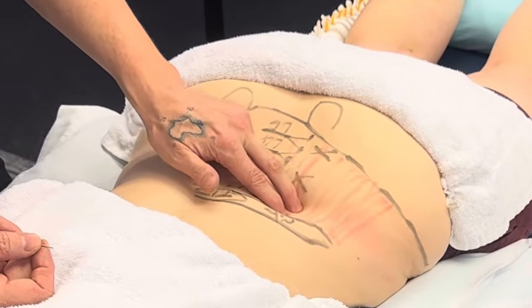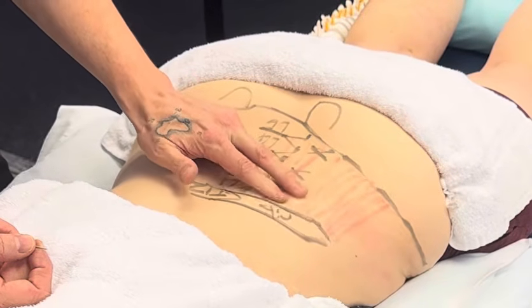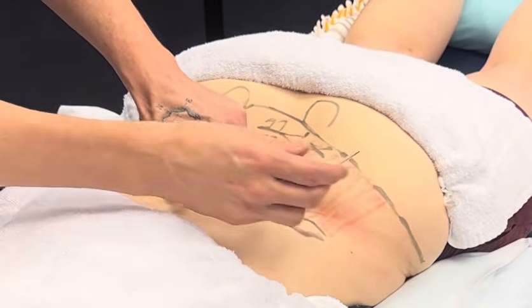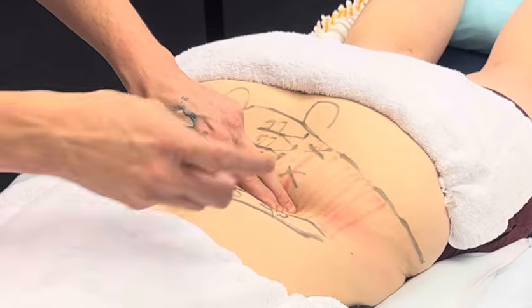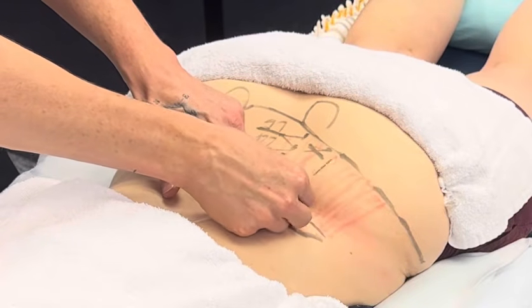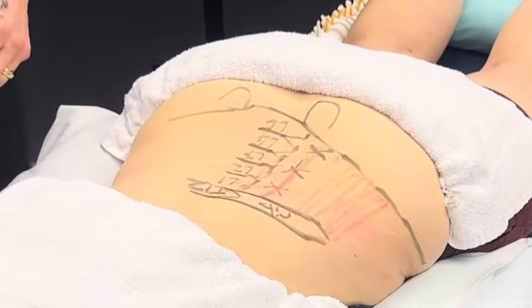So again, forget what you can see. Just gonna roll over the paraspinal muscle bulk. There it is. Okay. I'm gonna look, and I'm gonna go ahead and angle it. There's 45. We can be extra precautious and do like 60 degrees. There's a twitch. There's the bone. Okay? Are you good? Mhm.